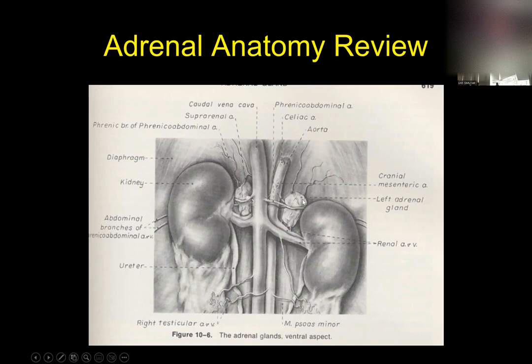But I have to recognize that could be a part of the adrenal gland. And then I have to keep cutting further, and then I get more and more convinced. And to make my adrenal gland really pretty, most adrenal glands are not going to be exactly running north to south. They may be at some angle, the longitudinal axis of that adrenal gland, like this one. So not only do I have to fan my probe this way, but I have to tweak my probe from going straight up and down to going a little sideways. So I find what I think is the adrenal gland, and then I tweak my probe a little bit sideways, and boom, there it comes, and it looks like a really nice adrenal gland.